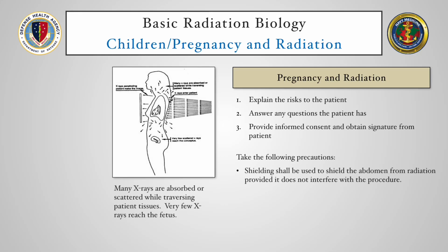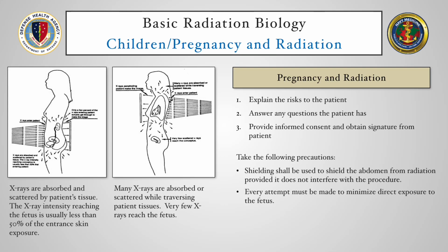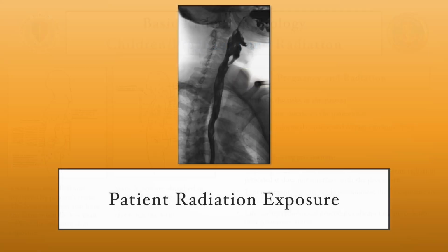Take the following precautions when you're doing the diagnostic exam. Shielding shall be used to shield the abdomen from radiation. Every attempt must be made to minimize direct exposure to the fetus. And of course, life-saving radiologic procedures always take precedence over pregnancy status. Next, we'll move on to talking about specific ways to reduce radiation exposure to our patients.